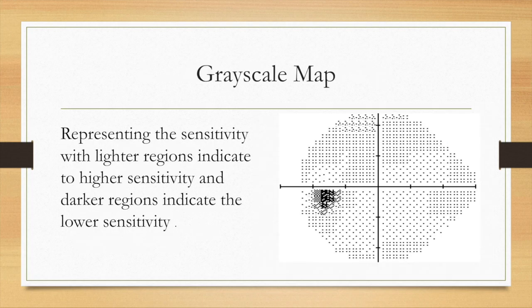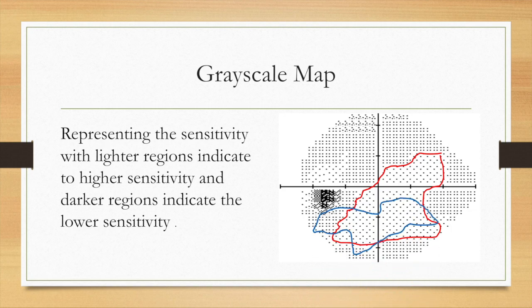Now the grayscale map represents sensitivity with lighter regions indicating higher sensitivity, as inside this red area. The darker regions indicate lower sensitivity, as in this blue area and green area.